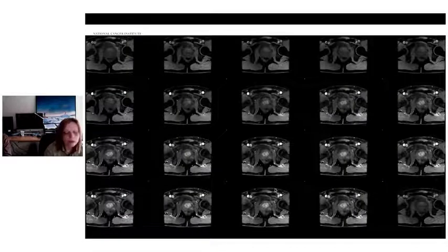For example, here you see dynamic contrast enhanced prostate imaging, and we have to acquire a lot of images in the dynamic sequence, about 30, where we evaluate how contrast comes to the prostate. Here we see a non-enhanced image, and here we can see slightly that some parts of the prostate are starting to enhance. For cancer, it is mostly important to see a fast enhancing lesion.